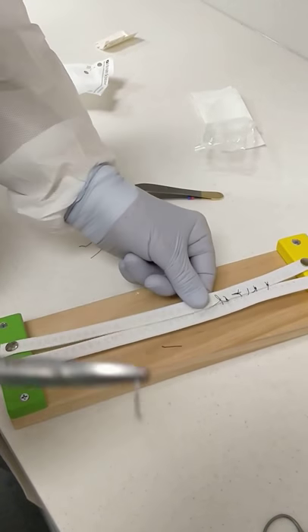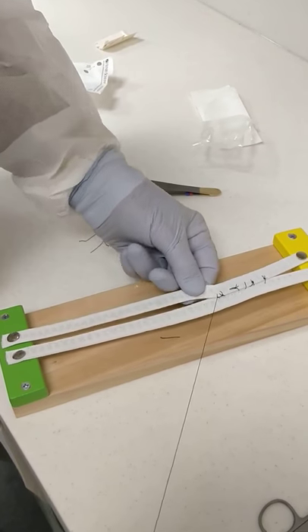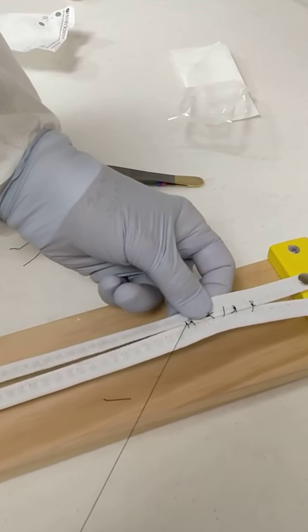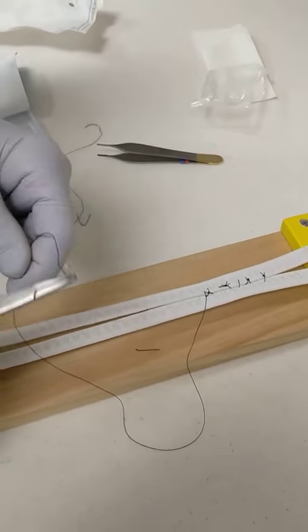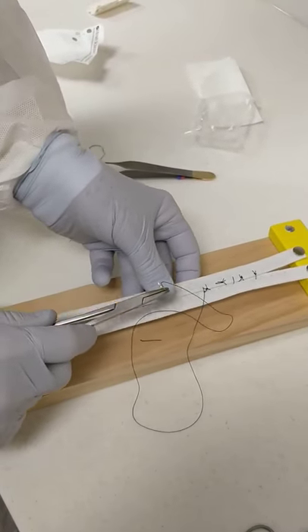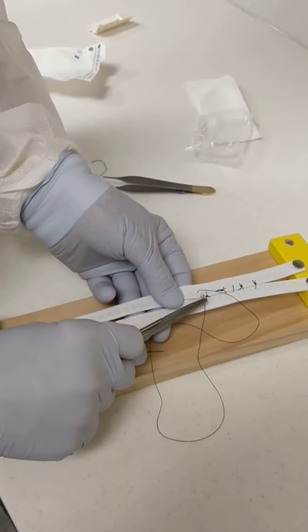And then you're going to pull it down. You can see how that twists as it comes down. That way, it won't unravel while you're passing your next suture.